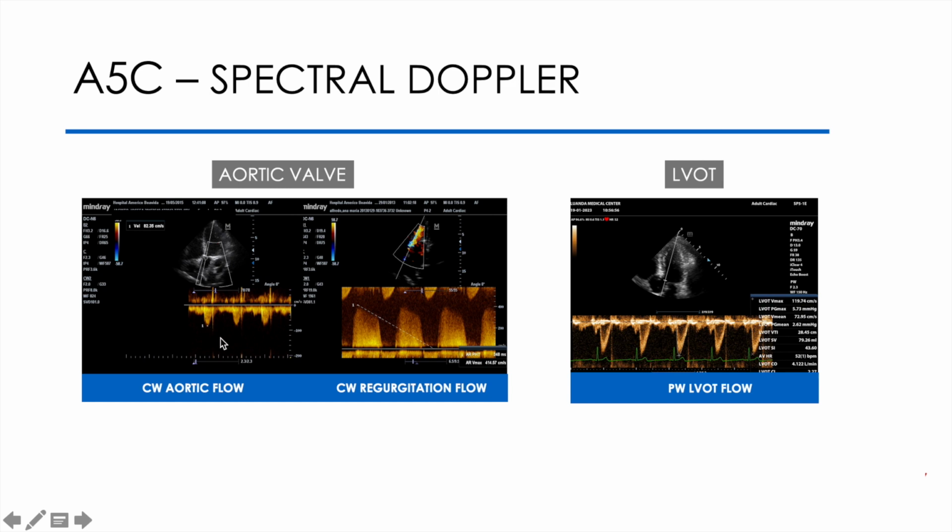If we diagnose aortic regurgitation by color Doppler, we must align the CW cursor over the regurgitant flow and we get a graph that looks like this. However, to evaluate the second graph that represents the speed of aortic regurgitation, I have to move the baseline further down.